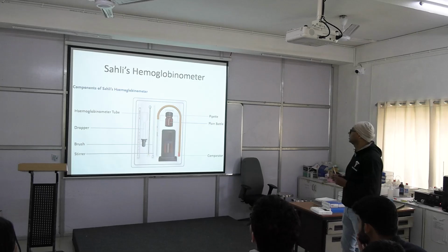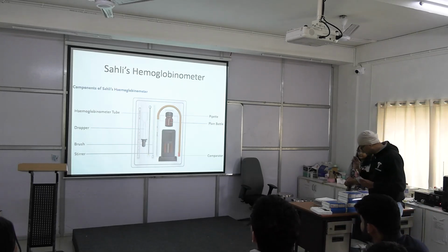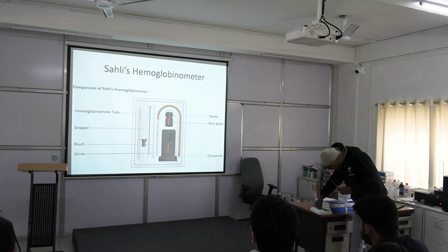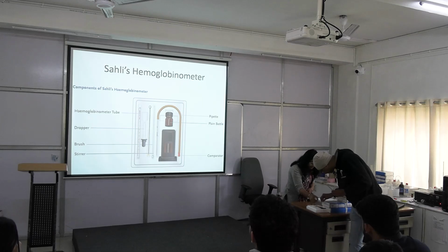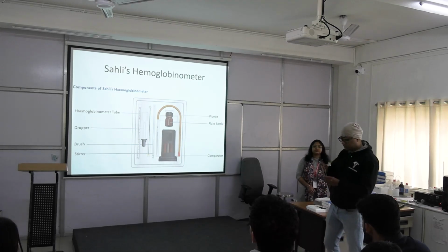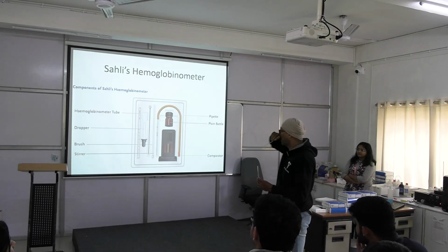Here are the contents, and also a stirrer, there is a glass rod. It is a stirrer, meaning for mixing.